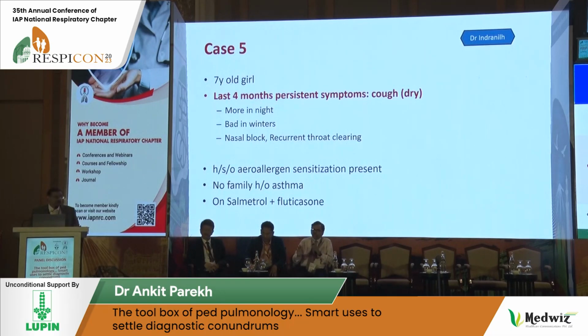So we totally agree with IOS; practically these are all changing. Now we can pick up more obstruction, and reversibility is also very good there. So IOS or FOT is a tool. If we have that advantage, it will pick up more, even in adults. In adults, we are doing that.